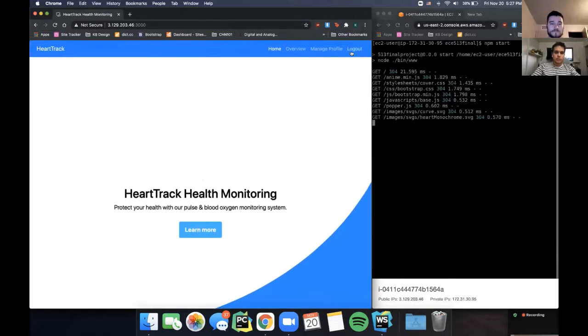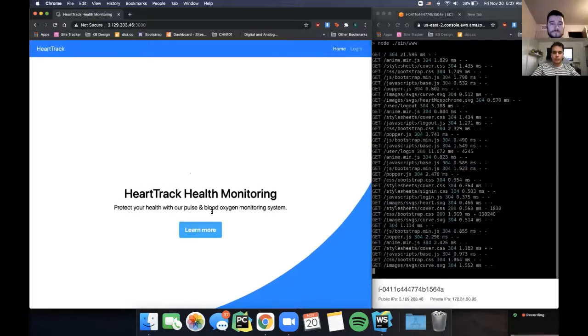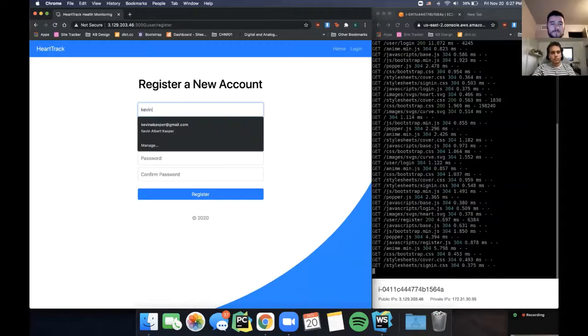So this is HeartTrack. I'm going to go ahead and log out. And this is our homepage, just small credits, an info page coming soon. So let's go ahead and make an account. This is our sign-in page. Click Need an Account. And we're just going to make a new account.